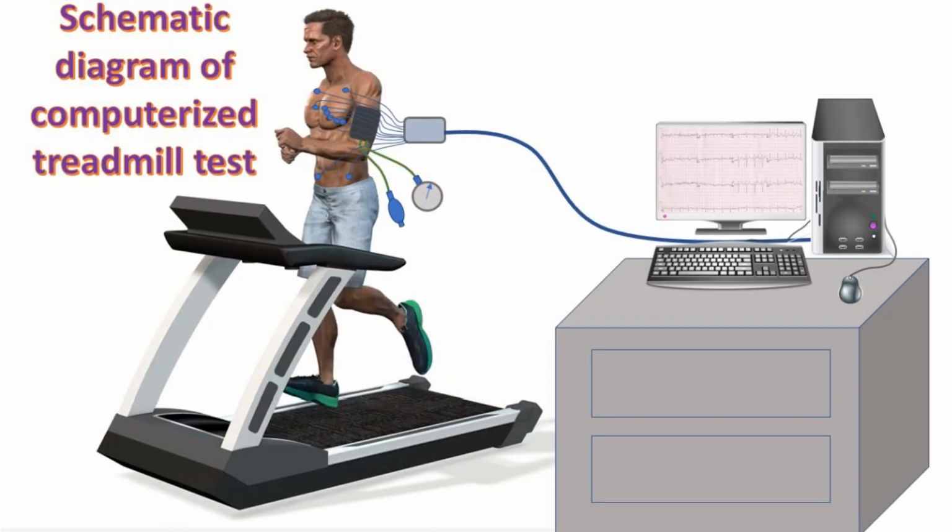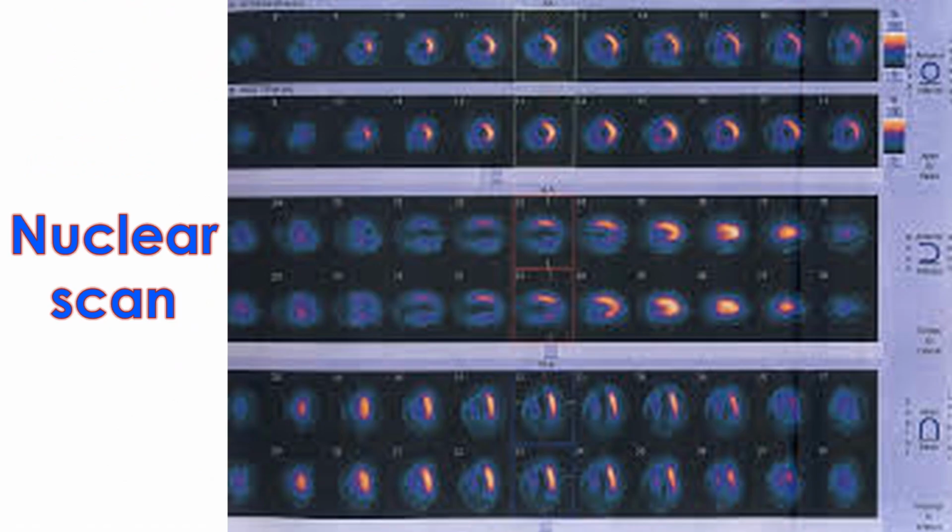While exercise ECG tells you that there is a probability of obstructions in coronary arteries, it most often does not identify the region of myocardium supplied by the obstructed vessel. A nuclear stress test will tell you which region of the myocardium is affected.